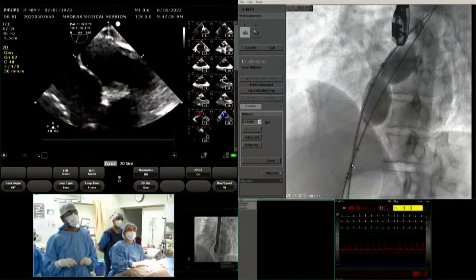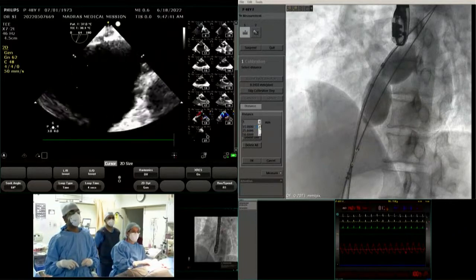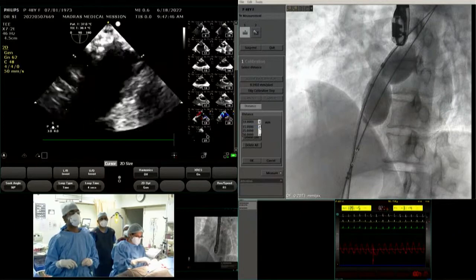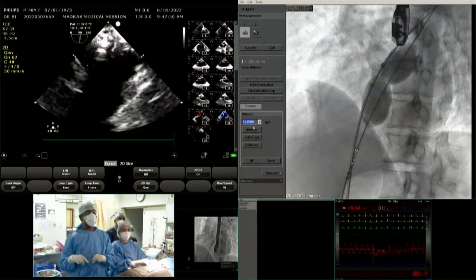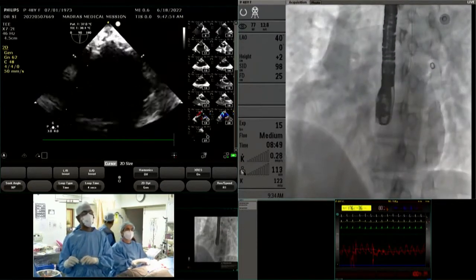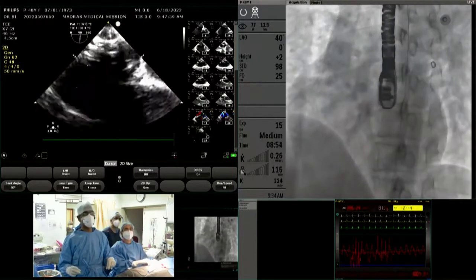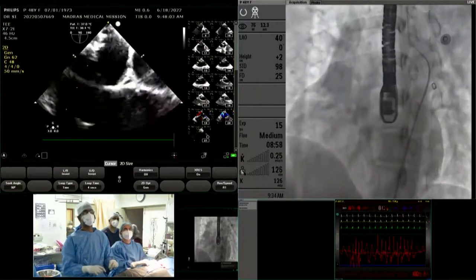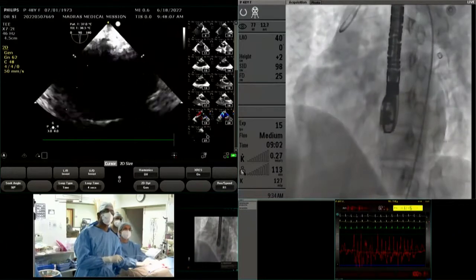Yeah, Dr. Rita, you had a question? Sir, on the 2D, after you did the balloon sizing, were you still able to appreciate a posterior rim, sir? It looked small in the initial. I mean, actually, the inferiorly located ASD. Yeah, the inferior ASD does not have a very good margin in the postero inferior part. Yes, sir. And so, we feel that all the other margins are adequate, that it will get anchored. Sure, sir. We'll put the device and then we'll see.